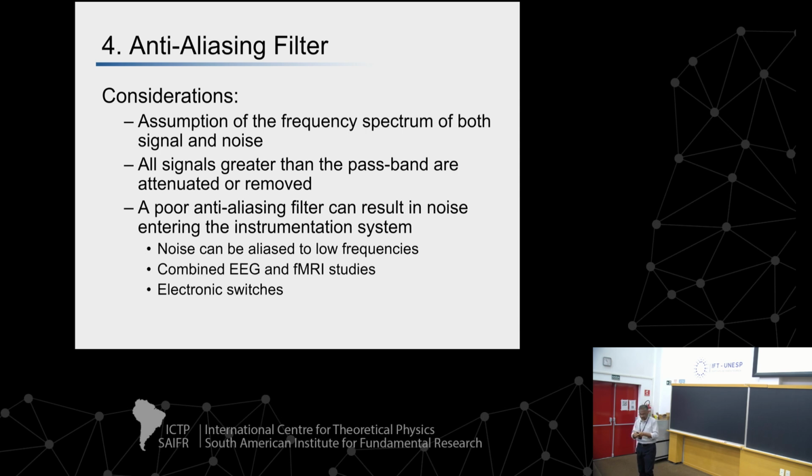We've also seen it with clinical systems where certain lights have a sort of strobing effect, or they have a regular square wave pulse within them, which then generates line noise at either 50 cycles or 60 cycles, depending on the country you're in, and harmonics of that. Because that's typically a square wave, those are odd harmonics. So let's say you had 60 cycle in the US, at 60, you had harmonics at 180, etc. That can be too large and can come into your signal because the anti-aliasing filter is not strong enough to remove it.